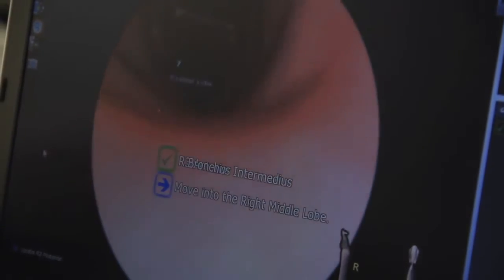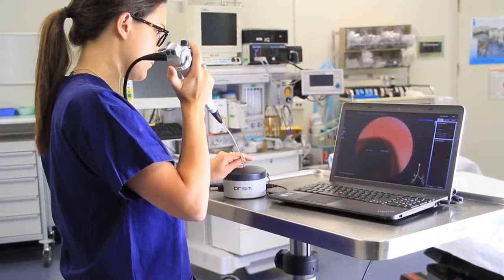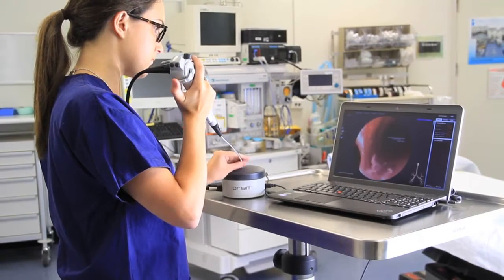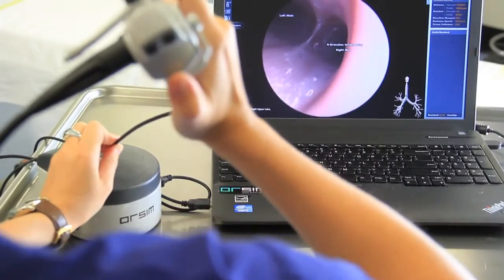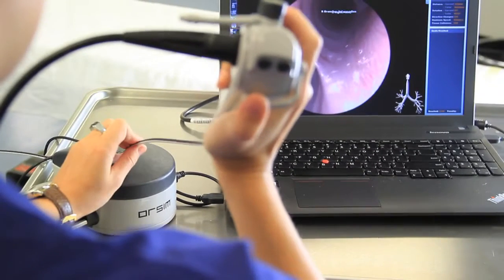We record everything, so when you're doing your scenario you can play it back to your tutor and go over what you've done to improve your learning experience. We can also invert the image, because some patients have to sit upright, so you can learn how to do that on a simulator before you have to work it out on a patient.